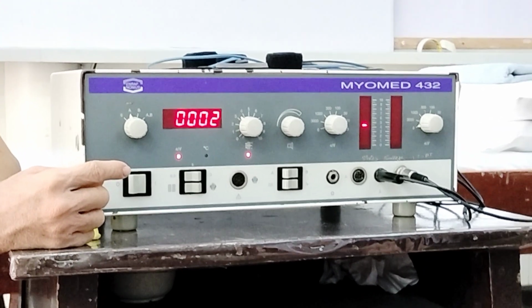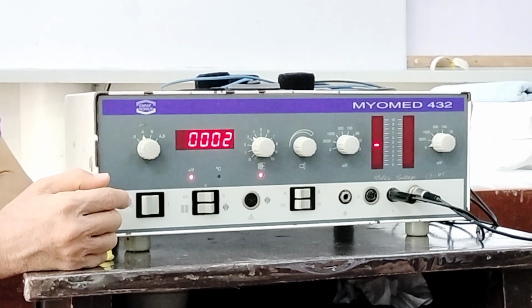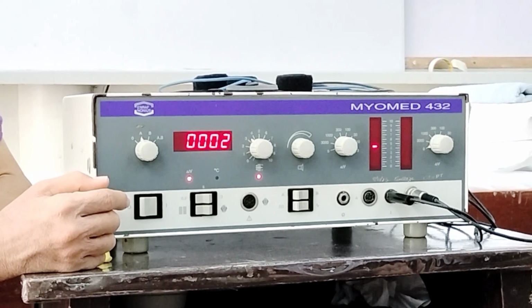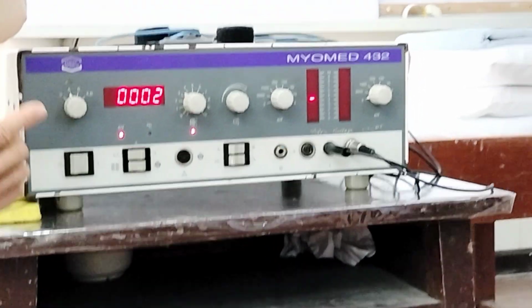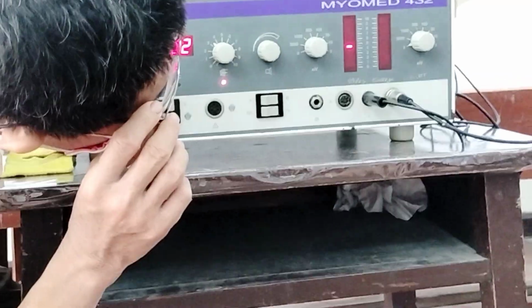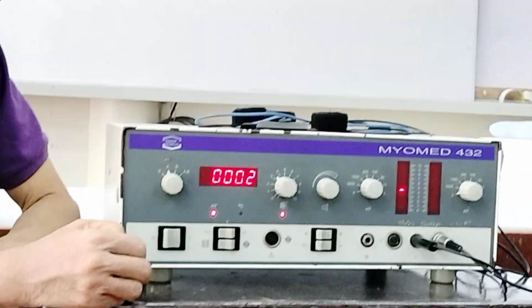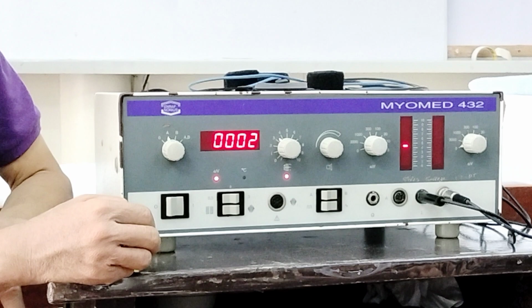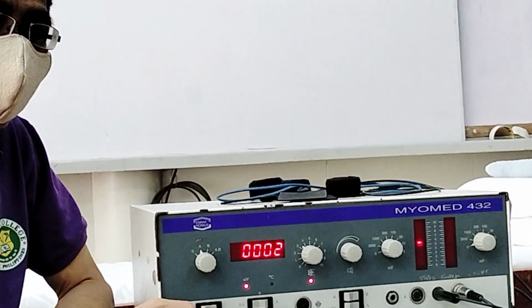So you place that at 10 microvolts. When you place it at 10 microvolts, the bar is reduced to what level? A level of 4.5. So take note that the muscle is still relaxed. There is no contraction.